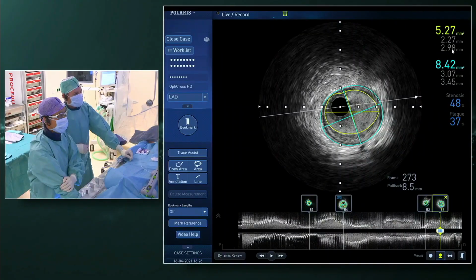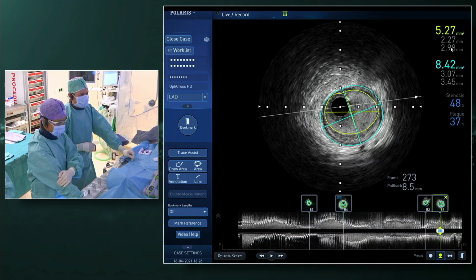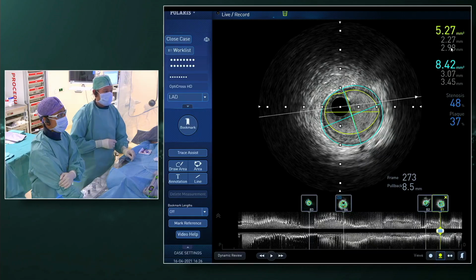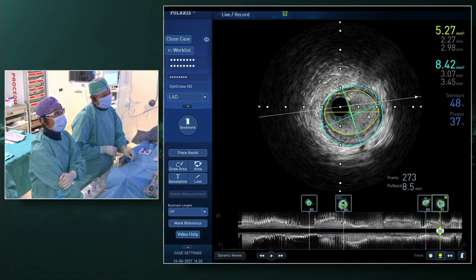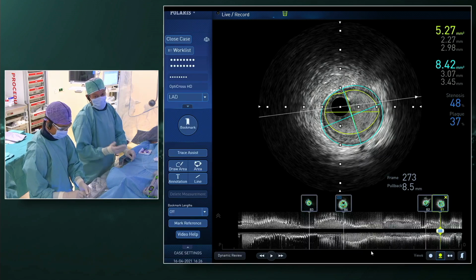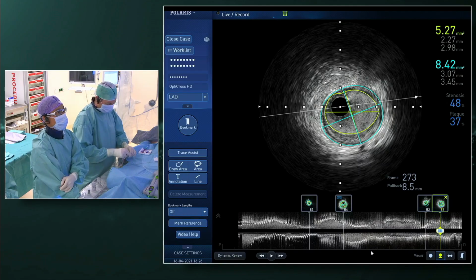So again, we were discussing this, but I think it would be good to treat both lesions, also because there is a CTO of the right, and this LAD really is also taking part in providing the inferior and lateral wall, at least for what is left of it, following the MI. So that's why we thought it would be good to treat the full vessel.